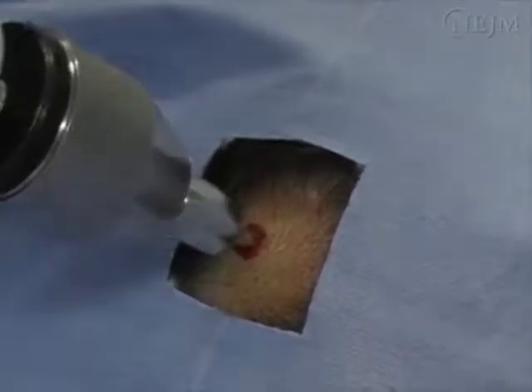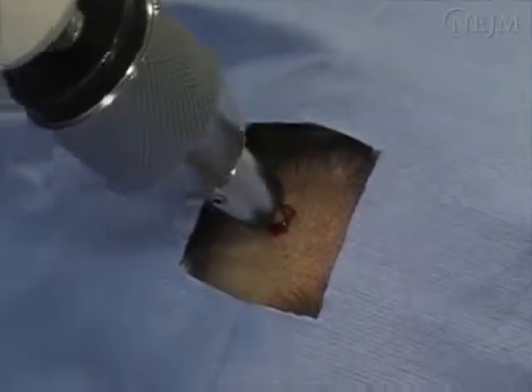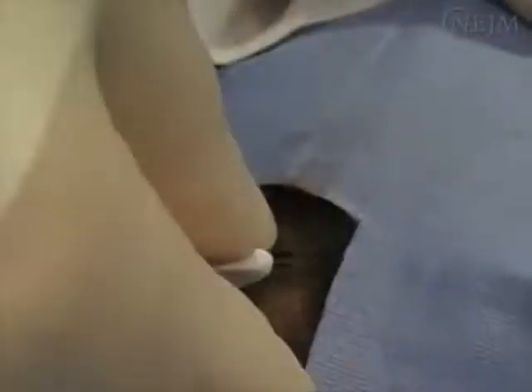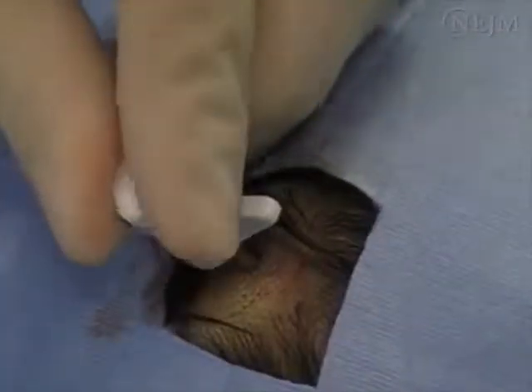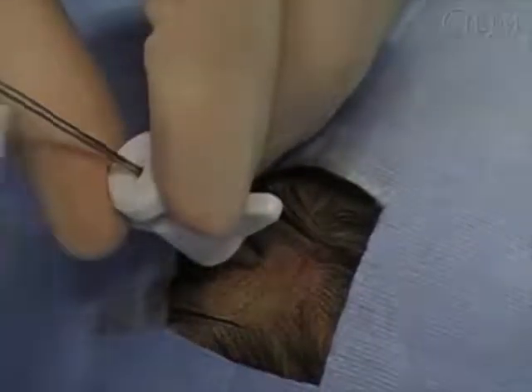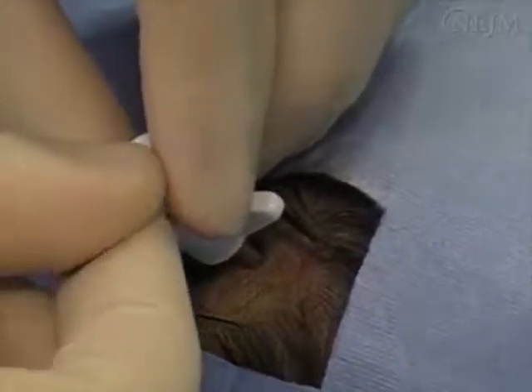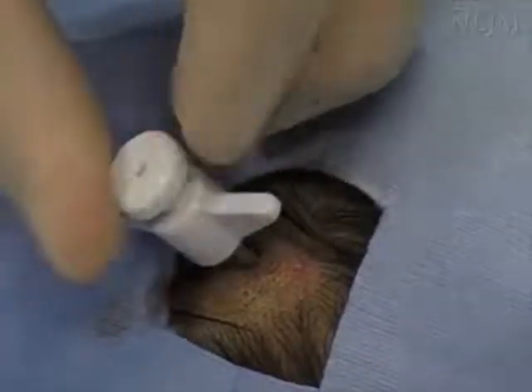You will usually be able to feel the drill bit penetrate the hard outer cortex, the soft central medulla, and the hard inner cortex. Place the bolt in position perpendicular to the skull and turn it clockwise, usually 9 half turns until it is secure. Loosen the cap of the bolt by turning the adapter counterclockwise and make a puncture in the dura using the dural puncture stylet. Cerebral spinal fluid may be visible at this point.